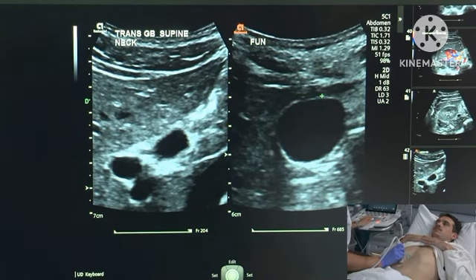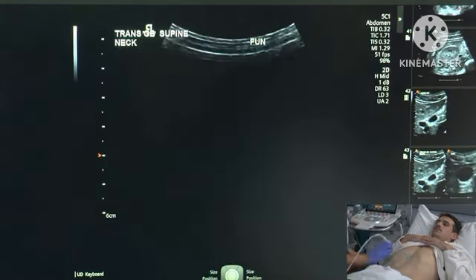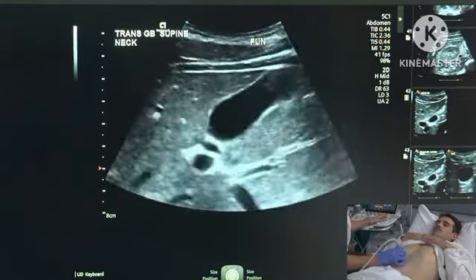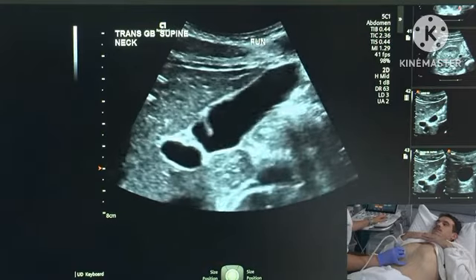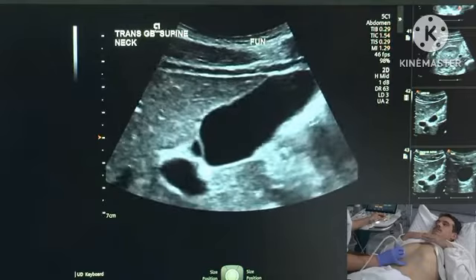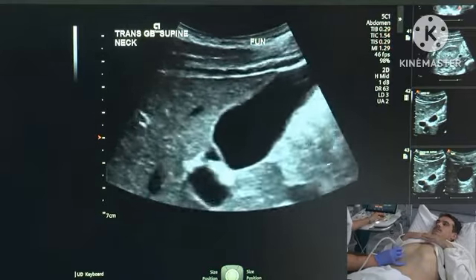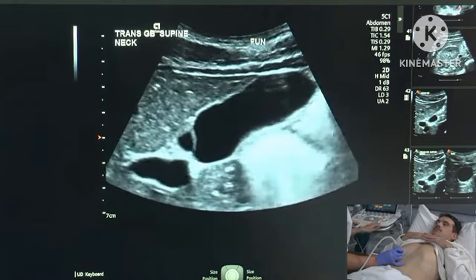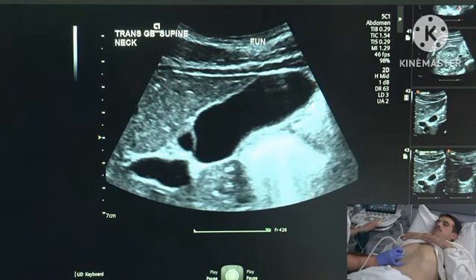When we measure the gallbladder, we're going to go from the echogenic line to the echogenic line. And his gallbladder wall is only measuring 1 millimeter, which is well in the normal range. The next thing that I'm going to do is take a longitudinal image of the gallbladder, a big breath in. And again, with him in supine, the most dependent portion of the gallbladder is the gallbladder neck. So I really want to make sure that I demonstrate that the neck is completely normal and that there's no stones within it. I can freeze the image there, breathe normally.